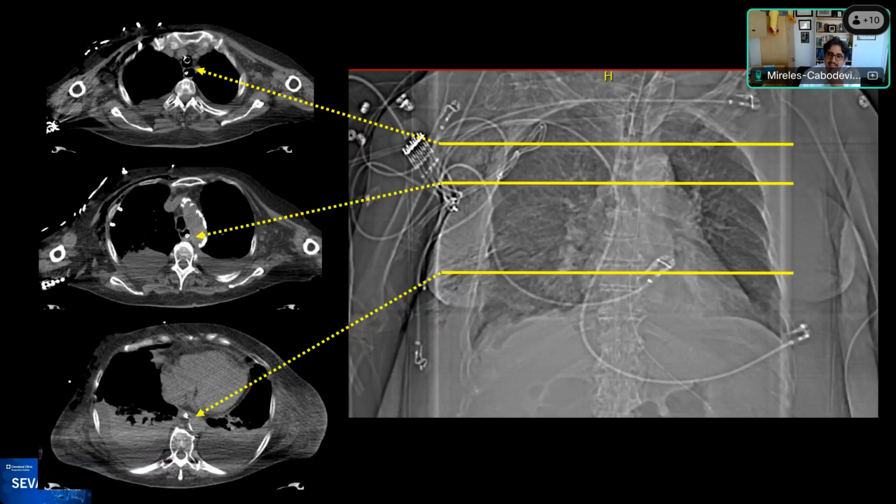And this is an image that we created. Although it doesn't have an esophageal balloon, it has a catheter in the esophagus. And this is just to demonstrate, because not all the time it's evident to all our caregivers where the esophageal balloon stands. And what you can see here at this level of cutting, you have the endotracheal tube, you have the trachea, and you have the esophagus, which in this case is full of air, but in the center you can see that there is a radio-opaque structure, and that's the catheter that is going to the stomach.